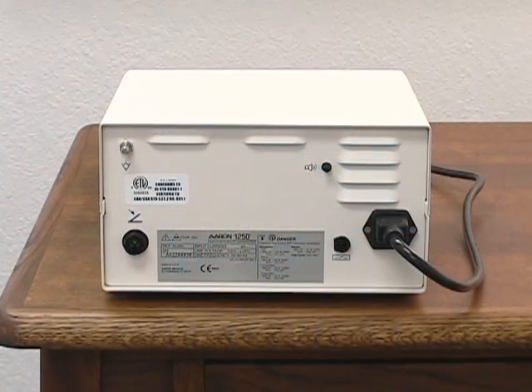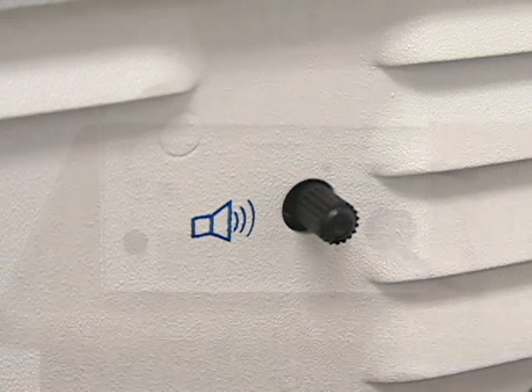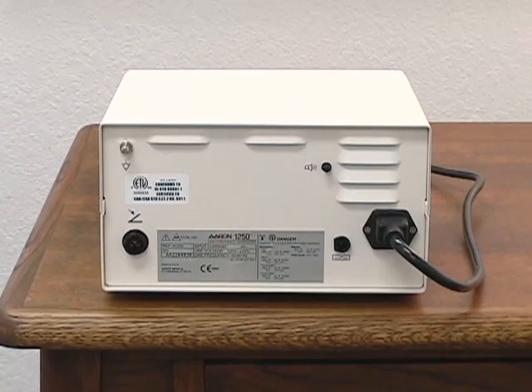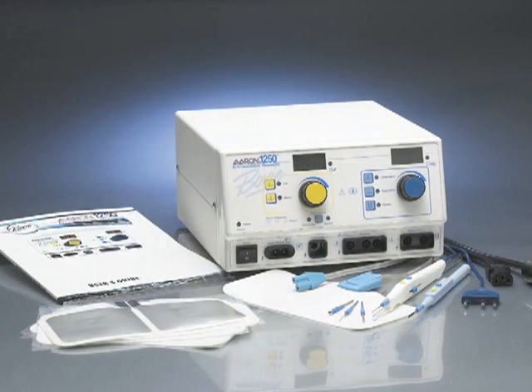The ARIN 1250 activation tone volume is adjustable. To adjust the volume of the activation tone, rotate the volume control knob on the back of the unit clockwise to increase, or counterclockwise to decrease the volume. The alarm tone volume is not adjustable. Your ARIN 1250 is now ready for use.